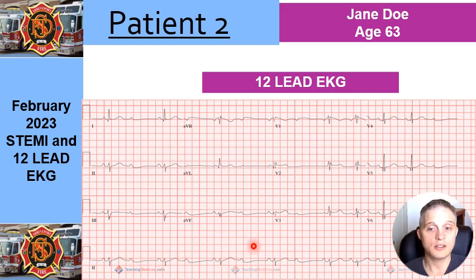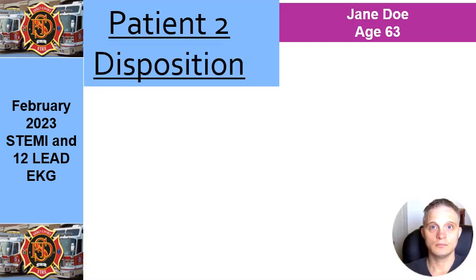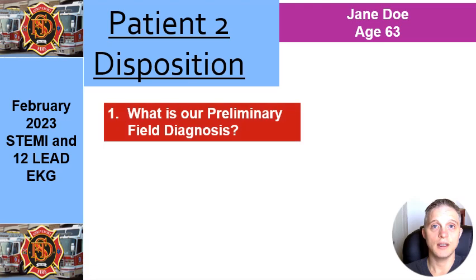3rd degree heart blocks are serious. They can kill patients. And so we have to continue. The QRS is tight. The T waves are present. The ST segments are universally isoelectric, and our axis, well, it looks a little left-sided, but that's beside the point. So we need to think about, what do we need to do? So again, we need to think about what is our preliminary field diagnosis. Here, in this instance, we have a discontiguous P and QRS complex, but we have stability and it walks out. That means it's third-degree heart block.